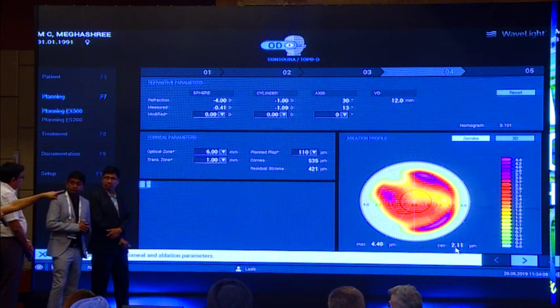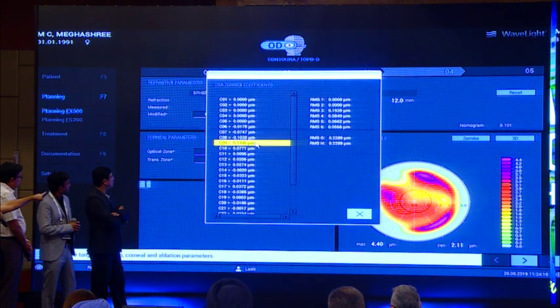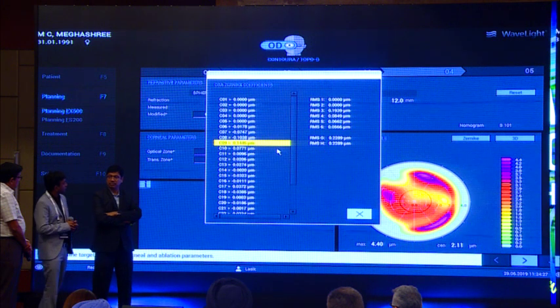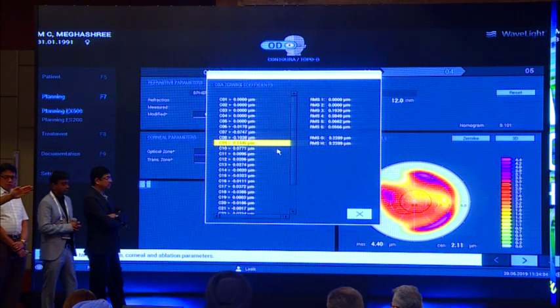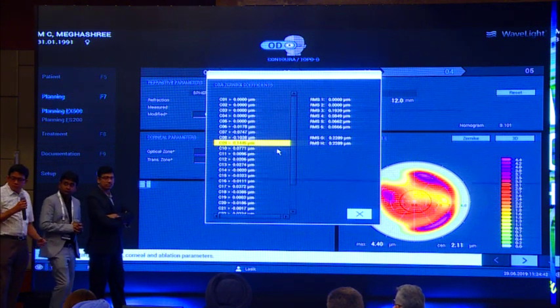Then Dr. Nitin also said very nicely that you go to the Zernike map and click on the Zernike, and you can see that the C9 and these factors are really on the higher side, which means that the patient has coma. So the machine's axis is driven by what your dominant factor is, and that is one of the reasons why the machine is showing us 13 degrees. Am I right? So in this patient, I would go by the axis of the machine, because you know that there is some issue out there.